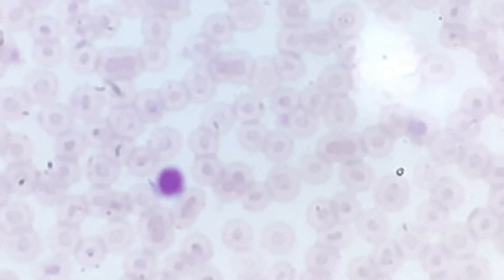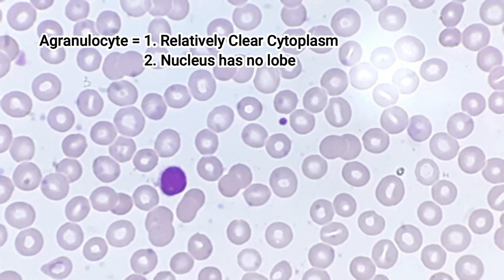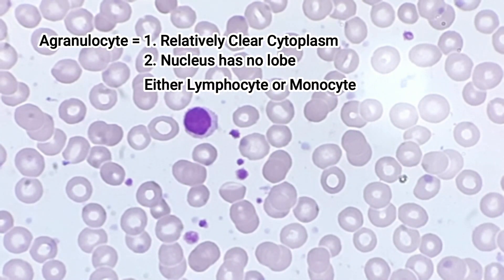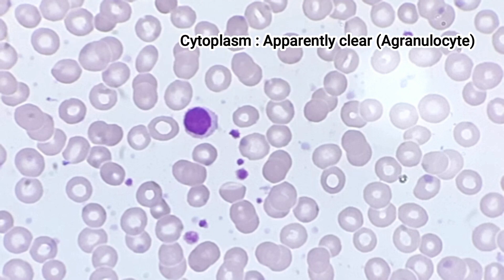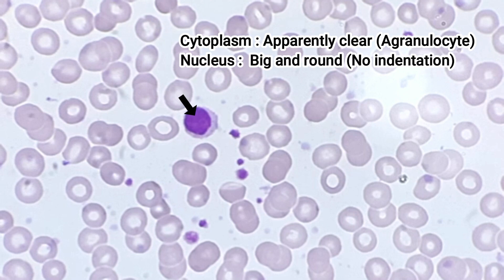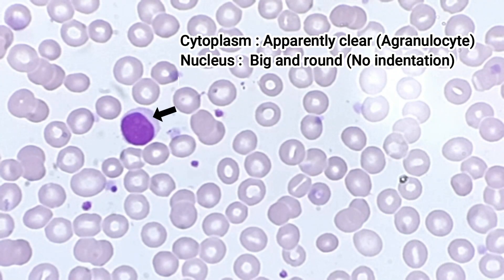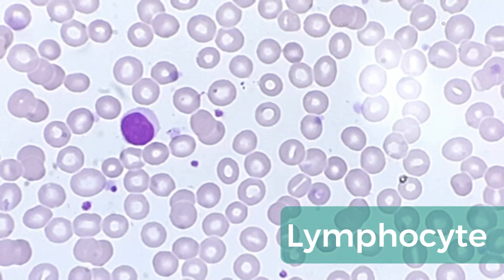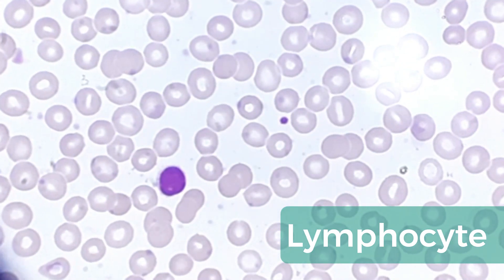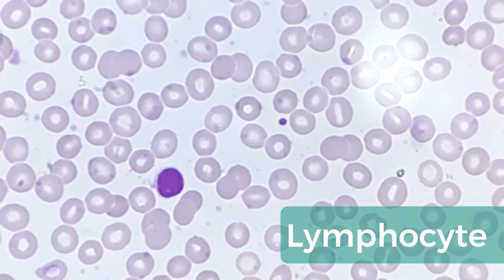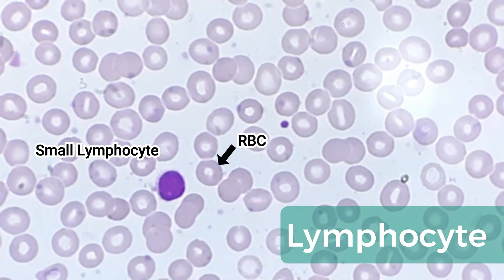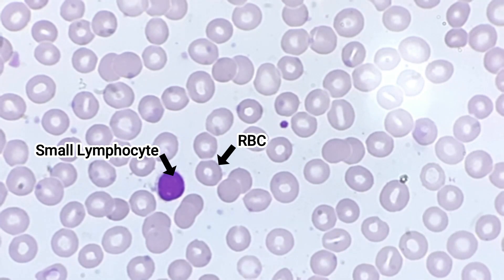Let's focus on the agranulocytes, which have relatively clear cytoplasm and nuclei with no lobes. You have to limit your thought to either lymphocyte or monocyte only. See this leukocyte with apparently clear cytoplasm — its nucleus is quite big, dark purple in color, round in shape with no indentation, and the nucleus is surrounded by a very thin rim of cytoplasm. It is obviously a lymphocyte. There are two varieties: large lymphocyte and small lymphocyte. The size of the nucleus of a small lymphocyte is approximately the same as the size of an RBC — you can easily compare that on the slide by the surrounding RBC in PBF.